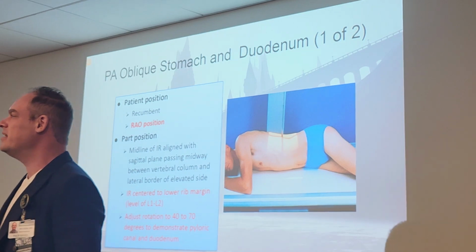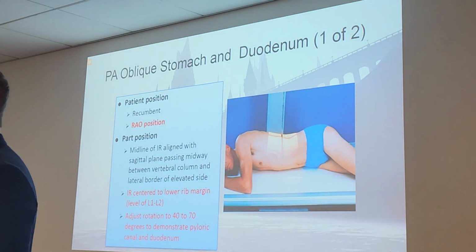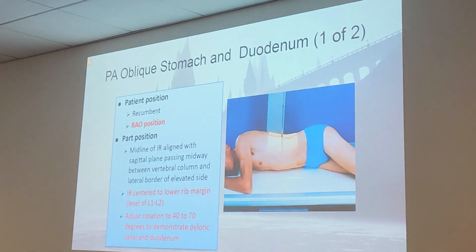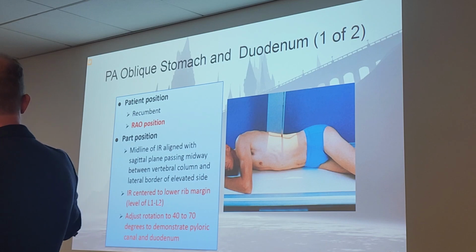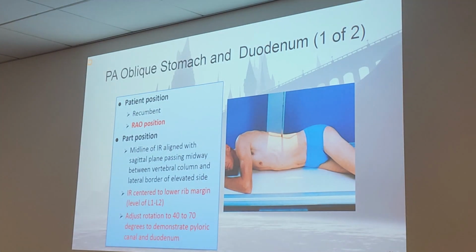Okay, PA oblique stomach and duodenum is a specific oblique, the RAO position. Where are we centering? Same spot, guys. Lower rib margin, level of L1, L2. That has not changed. We're just going to be in oblique, RAO, and we're going to center a little bit towards that elevated side. Now, here's where it gets kind of nasty again, guys, because they're not using 45-degree obliques.